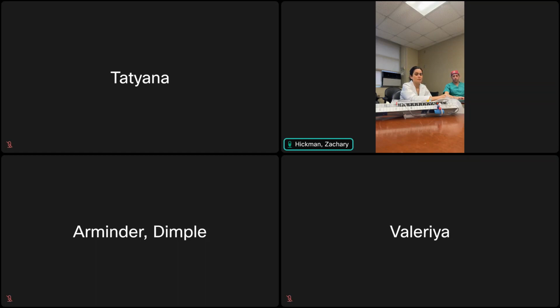Because you can technically tell the ICP on somebody from an EVD without having the number and without having a transducer. So if you drop, say, the water column, this is just a water column, say it's here at 15, and then I drop it down and it flows forward, and then I lift it up and it goes down from 15, your pressure is somewhere around 15, basically.